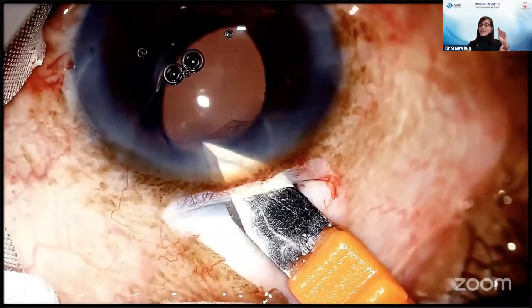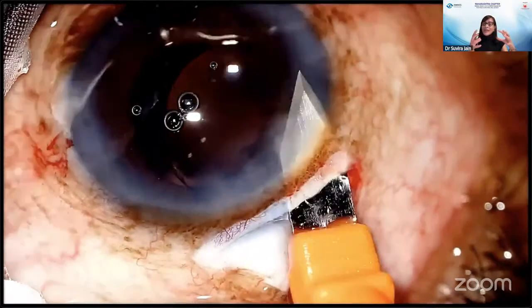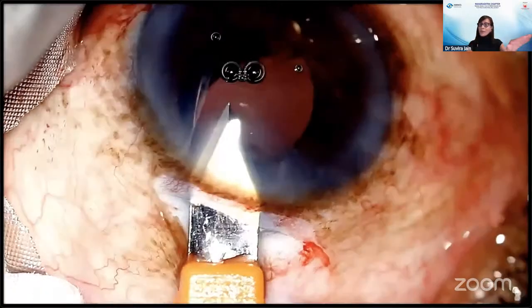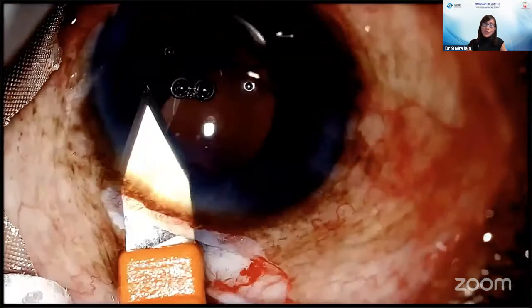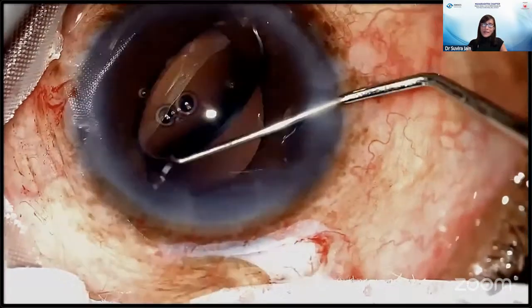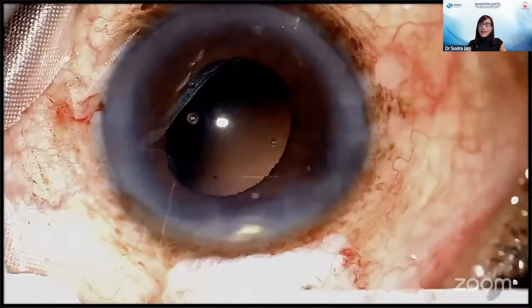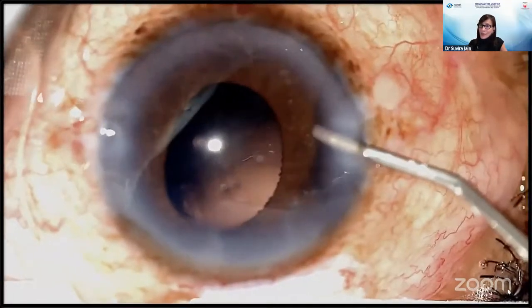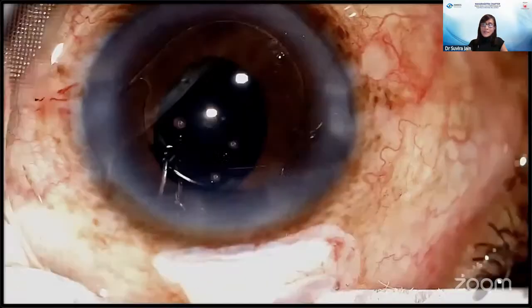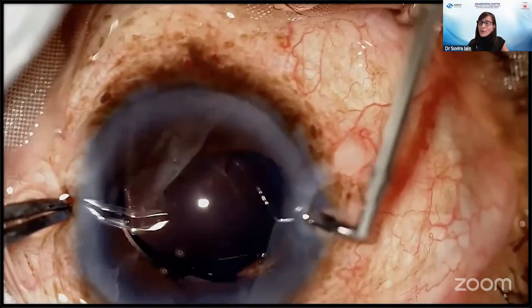Viscoelastic always needs to be used intermittently in these cases to give you adequate fixity, to be able to not only dissect the scleral tunnel, but also to get a clean opening when you're entering into the eye. Once the tunnel is enlarged, then the IOL is hooked upwards. Again, viscoelastic is introduced into the eye, and with the help of McPherson's, the IOL is extruded from the eye, after which another lens is implanted with ease into the capsular bag. There is no problem with the capsular bag here. We only had a broken haptic.